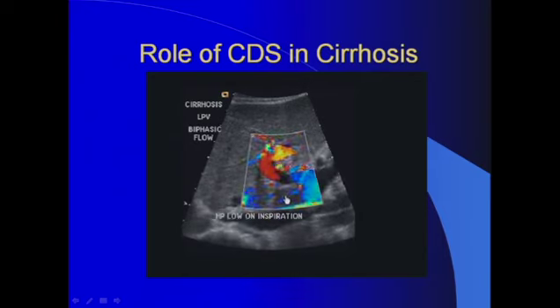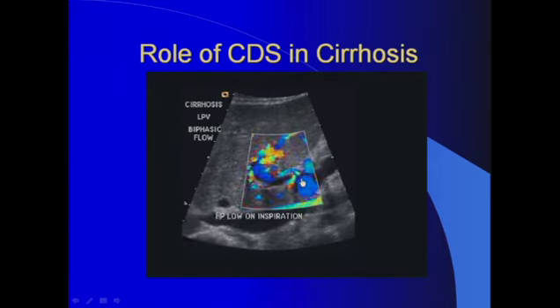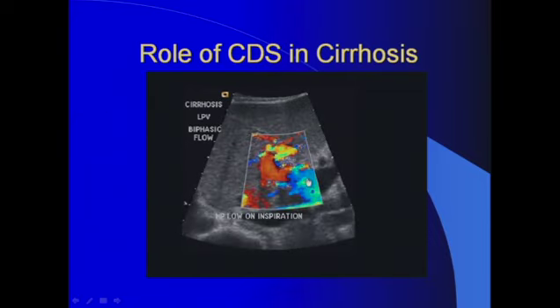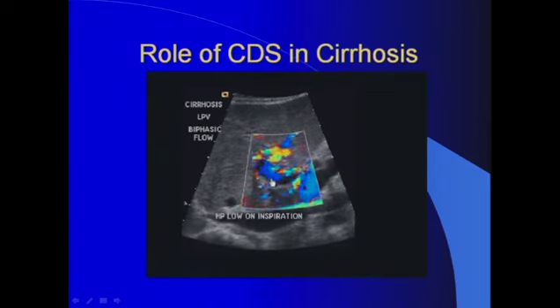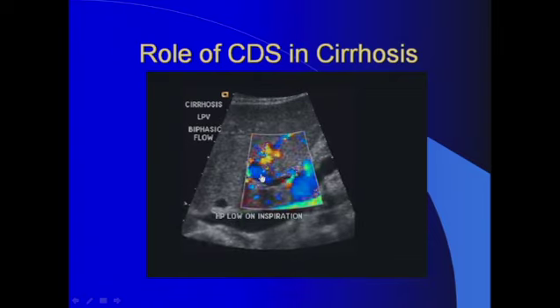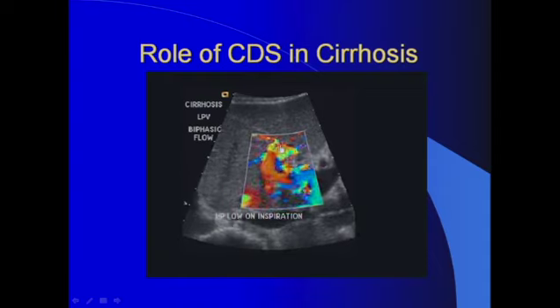In this example, we can see that there is obviously biphasic portal venous flow going into and outside of the liver. Look at this changing color from red to blue. In addition, you need to focus on what's happening next door in the arteries. Look at the high velocity aliasing in these arteries adjacent to the vein.